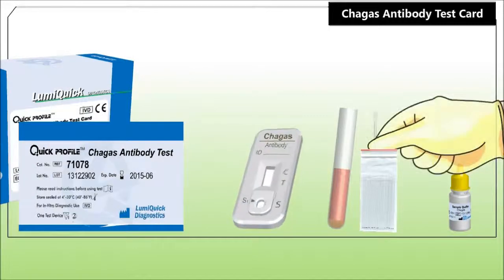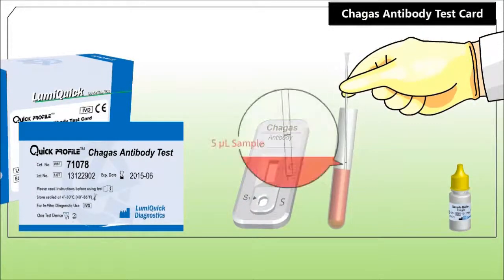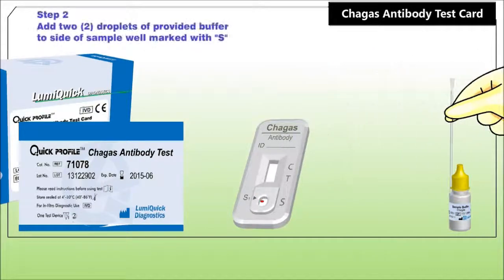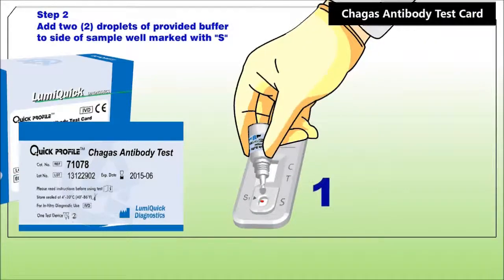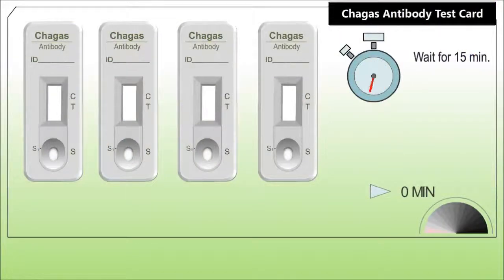With the provided micropipette, apply 5 microliters of serum, plasma, or whole blood to the area indicated by the arrow mark. Add 2 drops of sample buffer to the well marked as S. Start the timer and read the results at the end of the 15th minute.